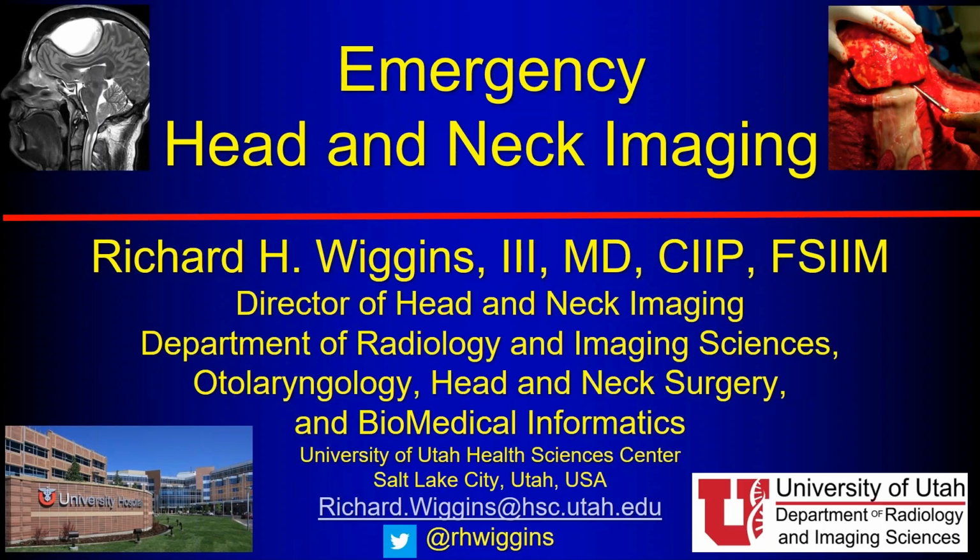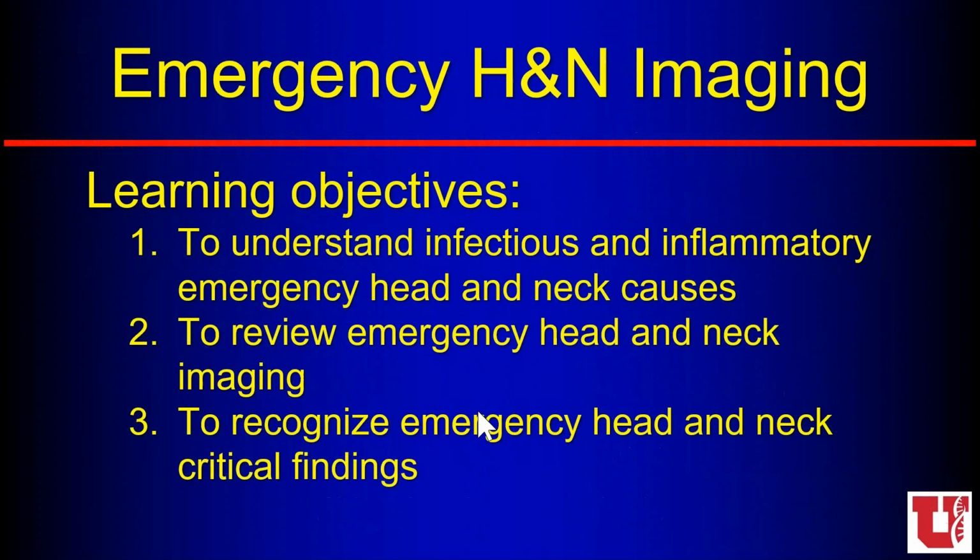These are both great examples of the power of CT and MRI and how we use these imagings and how it helps us image our complicated patients in the extracranial head and neck. So we're going to start off first talking about emergency head and neck imaging. So we'll talk about infectious and inflammatory processes and all these different areas, and we'll see how different they look.